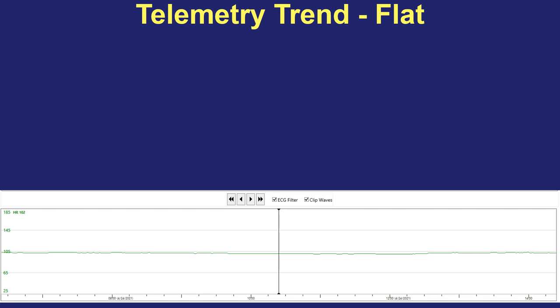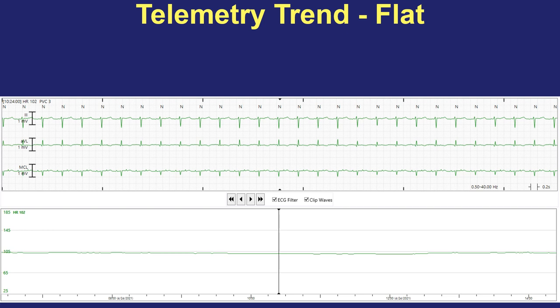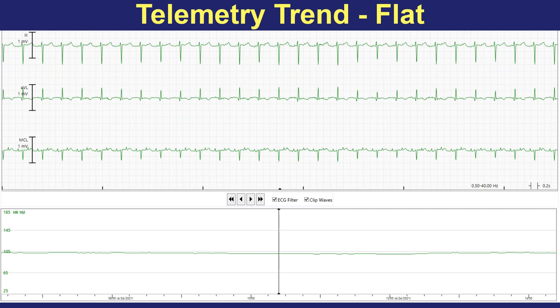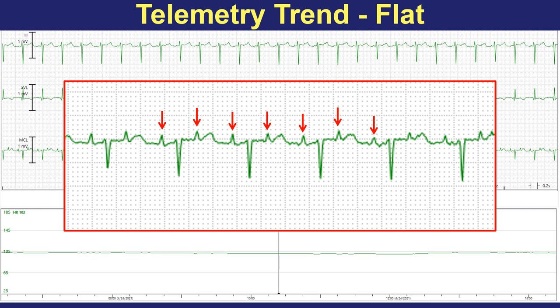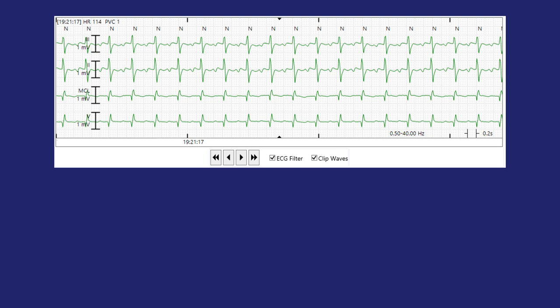Another huge clue to atrial flutter or atrial tachycardia is a very flat heart rate trend. Sinus rhythm and sinus tachycardia have variation through the day — during sleep, ambulation, pain, fevers — you'll see the heart rate rise and fall. When you see a flat heart rate that's railroad-track straight all the way across, that is just not going to be sinus tachycardia. You can also gain up the telemetry to see P waves, and now they jump out in the MCL lead in a two-to-one pattern, confirming atrial tachycardia with two-to-one AV conduction.